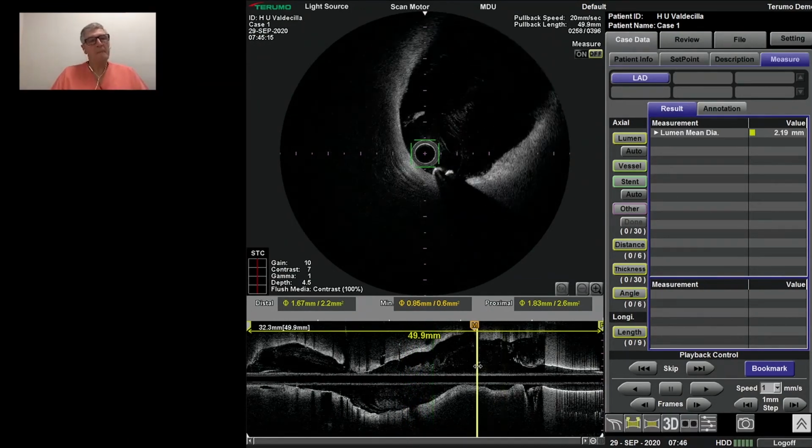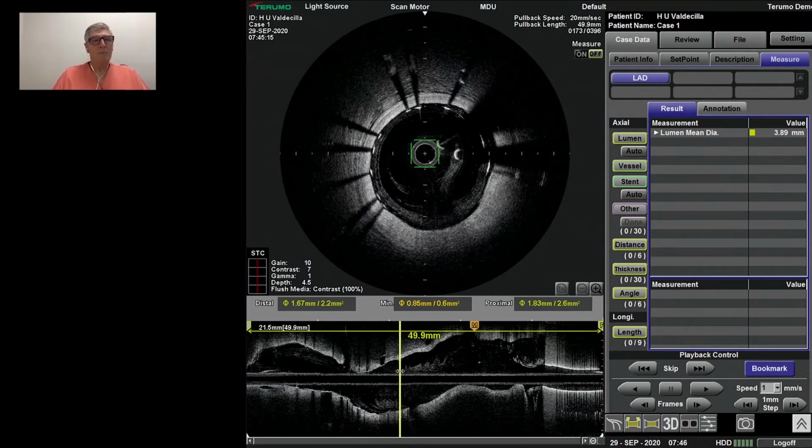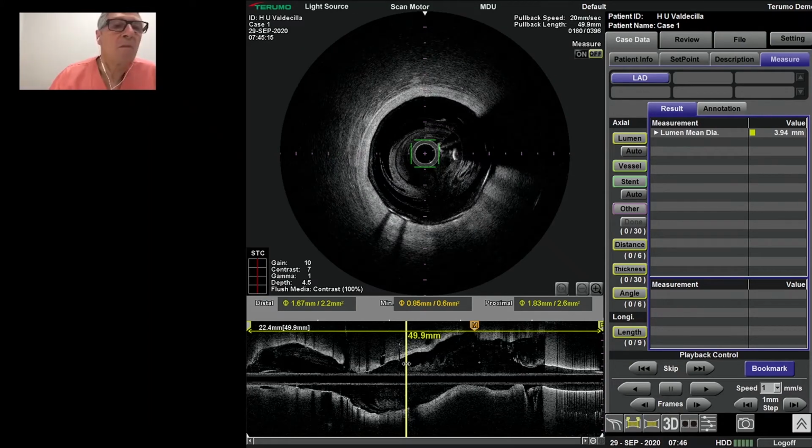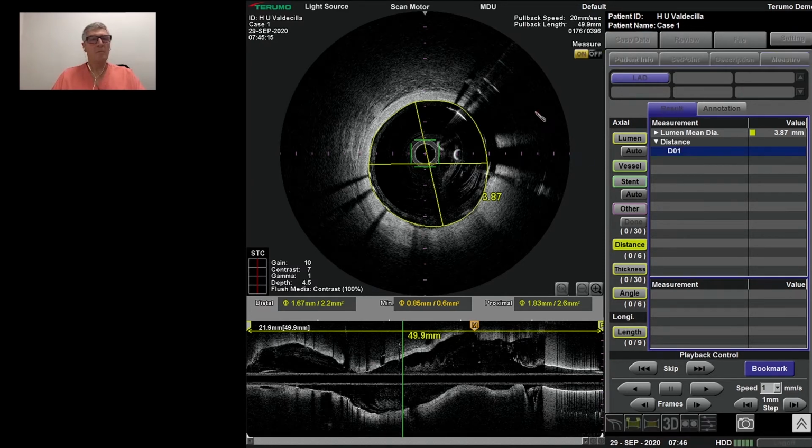You know that you can tolerate some minor degrees of malapposition because look at, stop there, stop, no, before. Just there, stop. Mide del estrato a la pared. If you measure the maximal distance, is so tiny that it's 0.15, 0.1. Yeah. Really, it's nothing. And the risk of going more aggressive in these cases is maybe to dissect or even rupture a healthy vessel at that point.